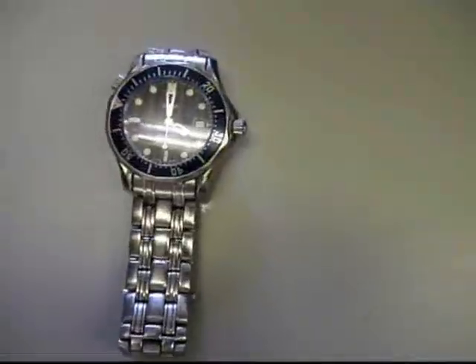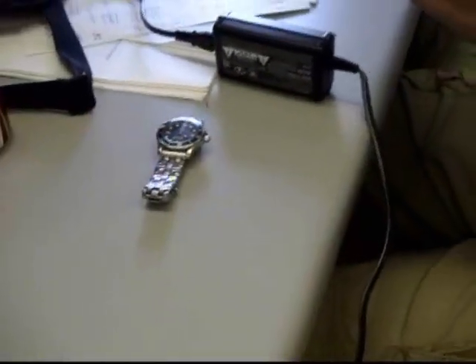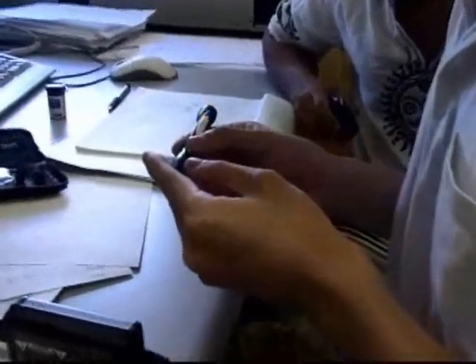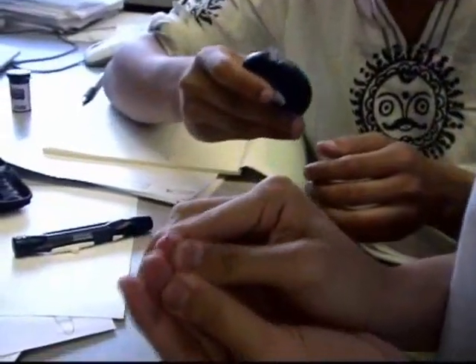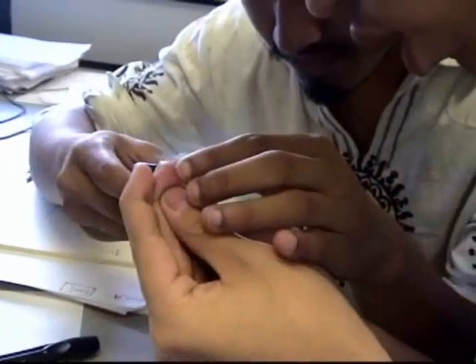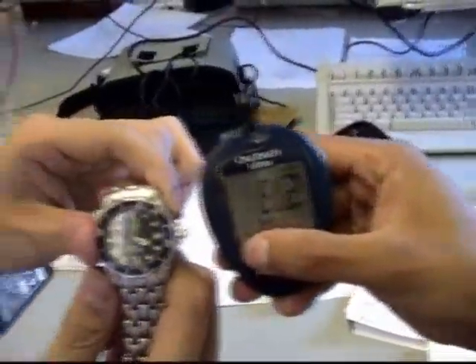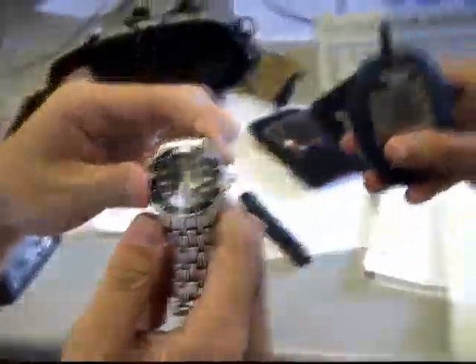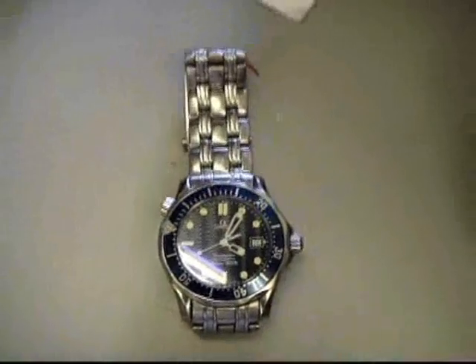Now it's 4 o'clock. We're going to take the fourth measurement. It's 8.2 millimoles per liter at 4 o'clock. We're going to do the final point now.